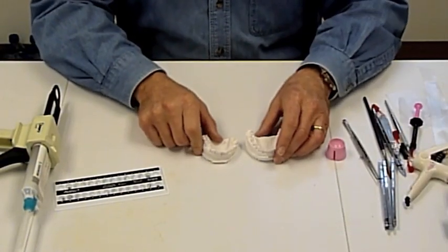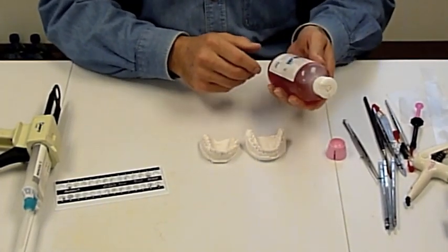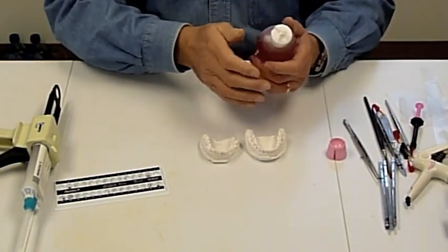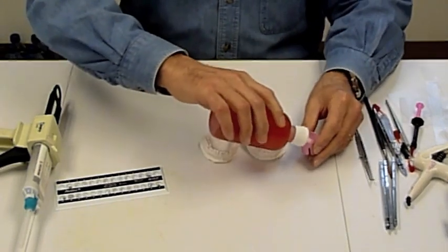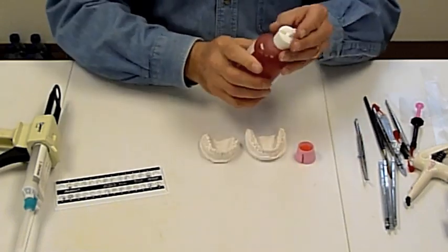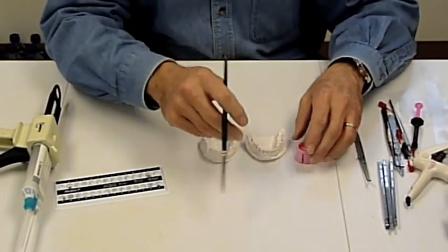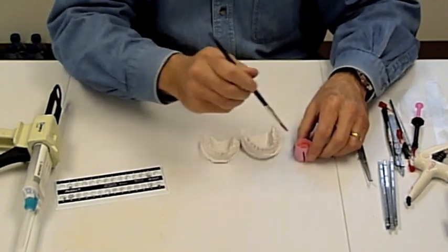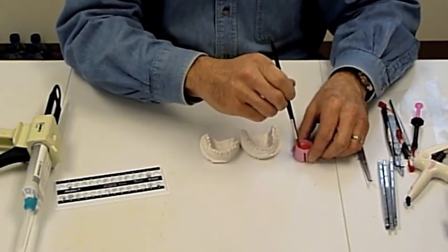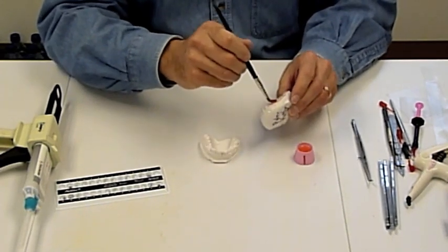Once we have the models marked, we will coat them with a separating medium. In this case, we're using one from Great Lakes called Liquid Foil. We'll paint the teeth with a separating medium with a brush so that we can easily remove the brackets after they're bonded to the teeth.